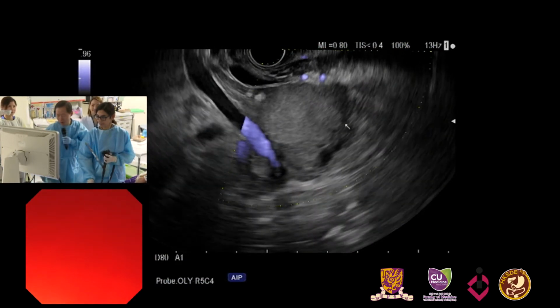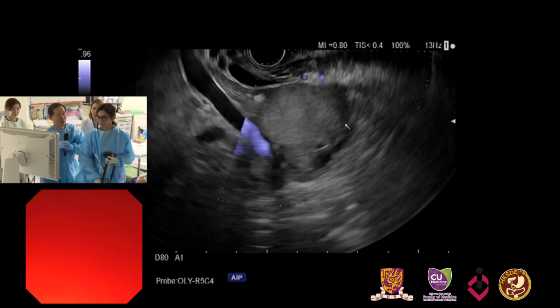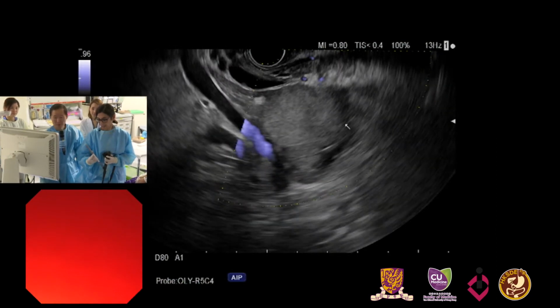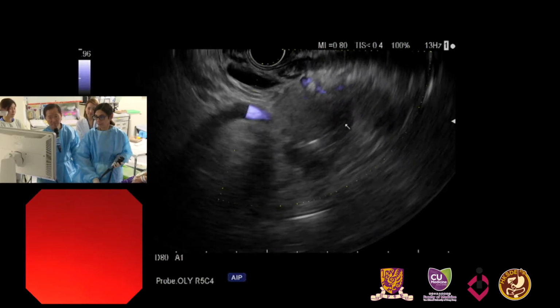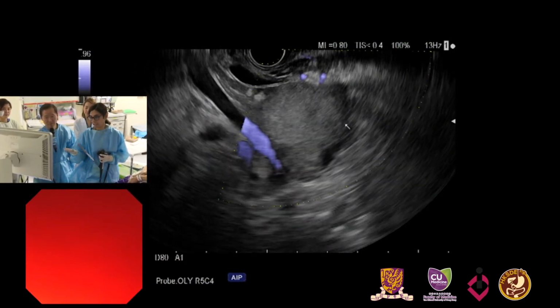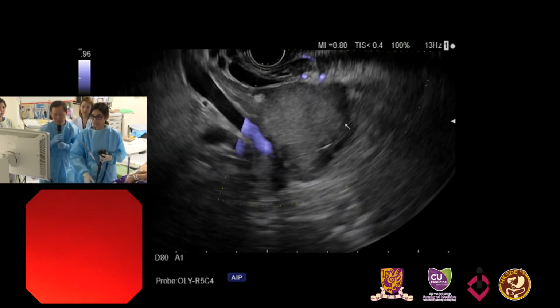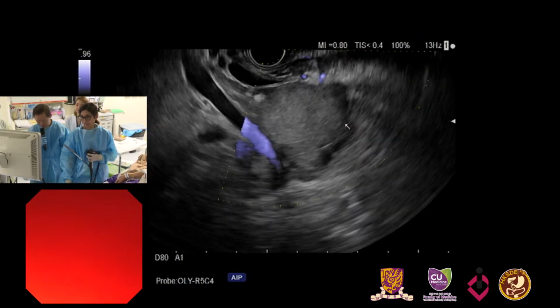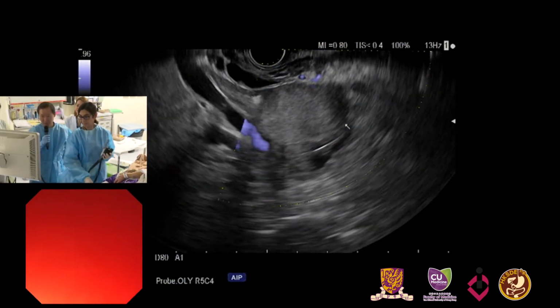Most of this type of bleeding will stop spontaneously, but I think it's better to give some antibiotics as a precautionary measure. That's what we were discussing, that they are going to observe the patient afterwards. I would give antibiotics. And obviously we continued to watch this until the bleeding did stop. Yes, and her vitals remained stable throughout. So hopefully she won't have any issues, but this has been described in the initial use of this forceps, so now you've seen it.